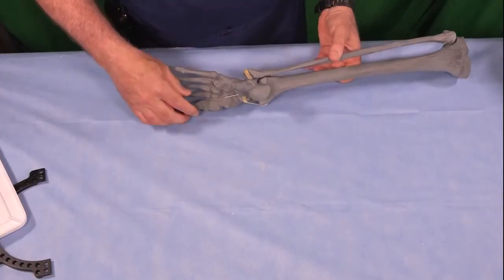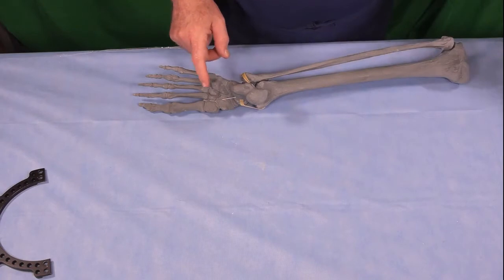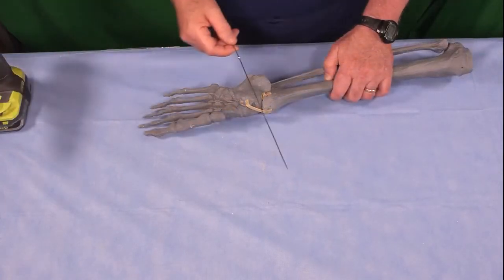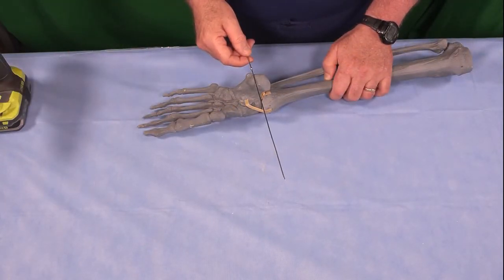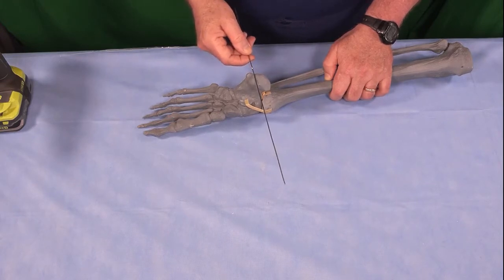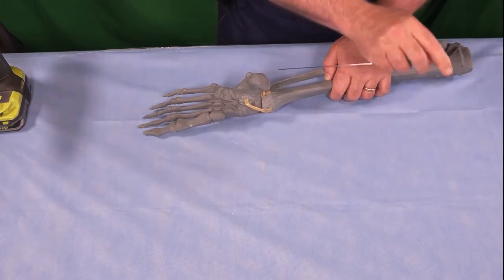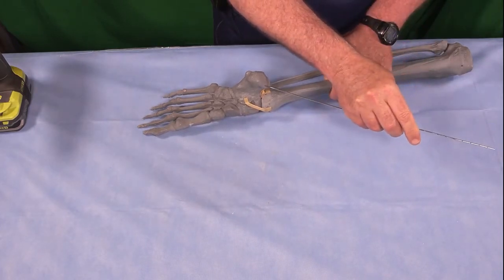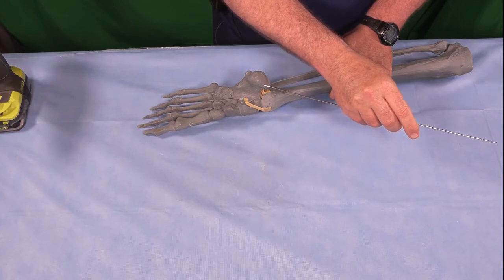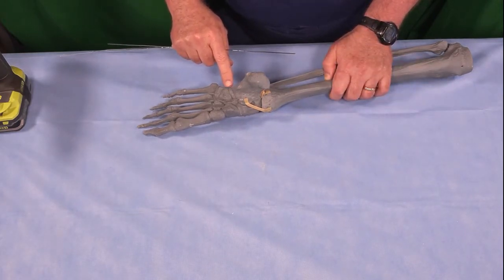I'm going to turn the foot over so you can see it. I have a temporary wire here just holding the 60-degree Equinus for me. We'll start by locking the calcaneus with two counteropposed olive wires. One transverse olive wire will come from the lateral side perpendicular to the calcaneus. The other one will come from posteromedial obliquely, not quite at a 90-degree angle, but exiting before we reach the calcaneocuboid joint.